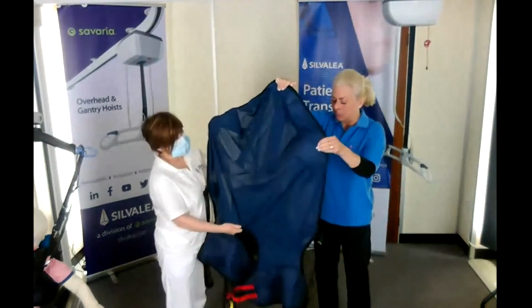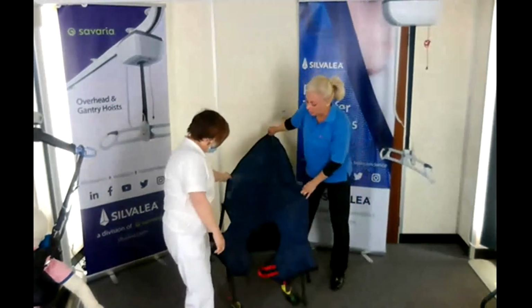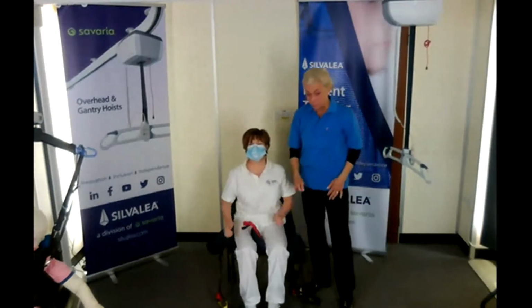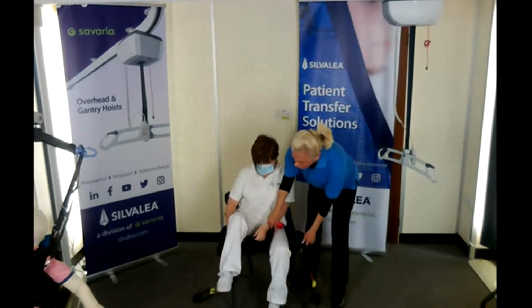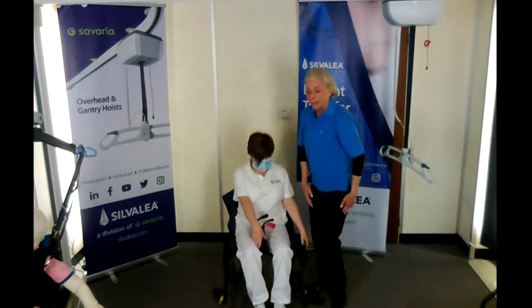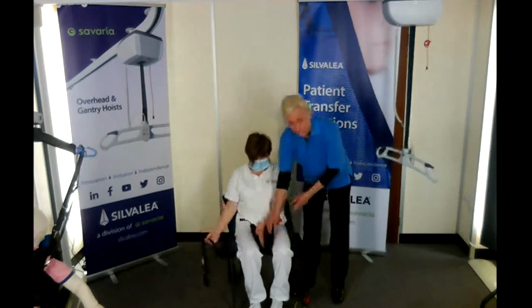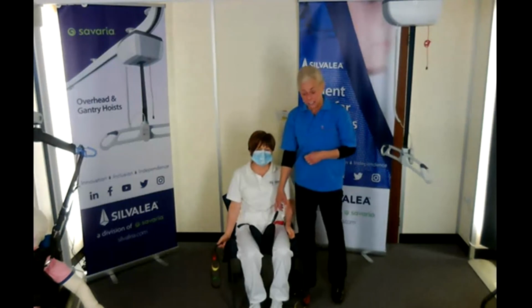This one has got built-in head support. And as I said, it's the most popular. It is divided leg, so we can put it on in a chair. The most important thing is to get the sling down as far as possible, ensuring that the leg sections come around to support the femurs fully. If it's positioned too far back and the leg sections are mid-thigh, it could bite in and won't give enough support. Legs have a parasilk covering to help with slidey fabric, so you can glide the leg sections in.